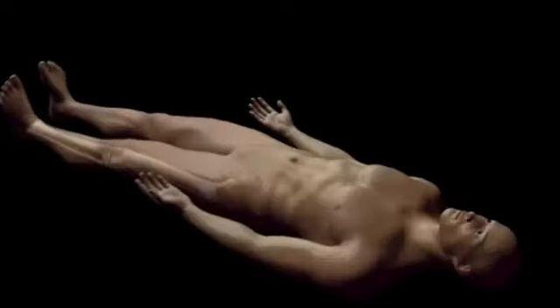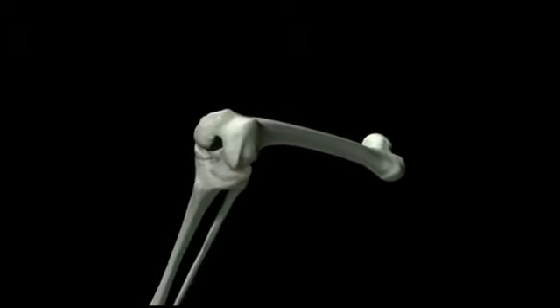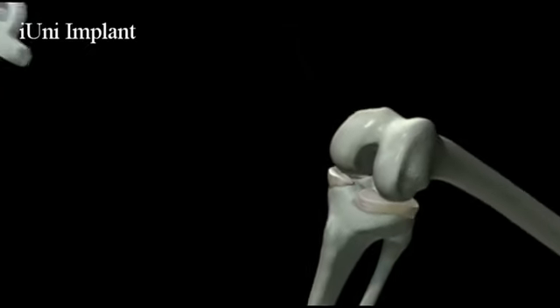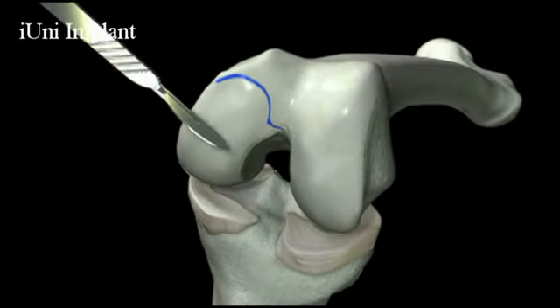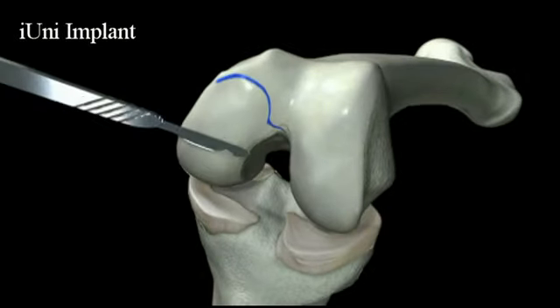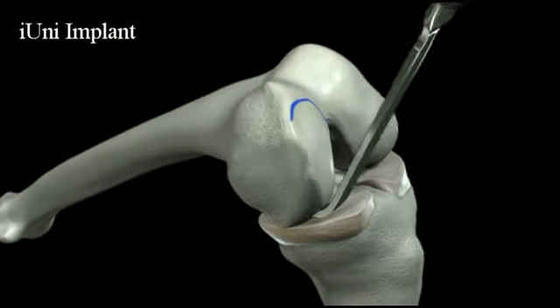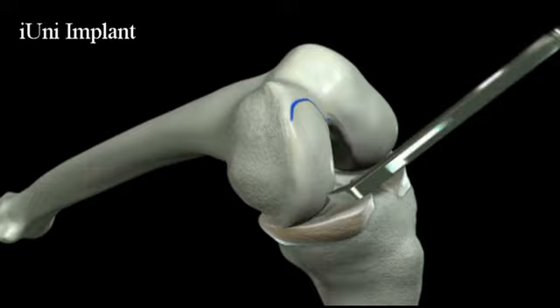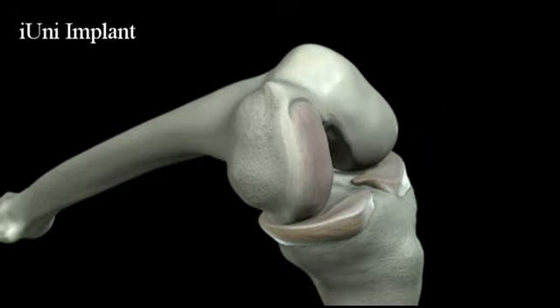Step 1. Site preparation. Position the patient on an operating table with the leg resting on a foot support at around 90 degrees of flexion. Next, place the femoral iJig on the condyle and mark the anterior edge of the femoral iJig. Remove all cartilage beginning about 2 mm posterior to this mark, including the posterior condyle, using a 10 mm blade and a curved elevator or ring curette. Then perform a complete meniscectomy and scrape residual cartilage from the tibial plateau.